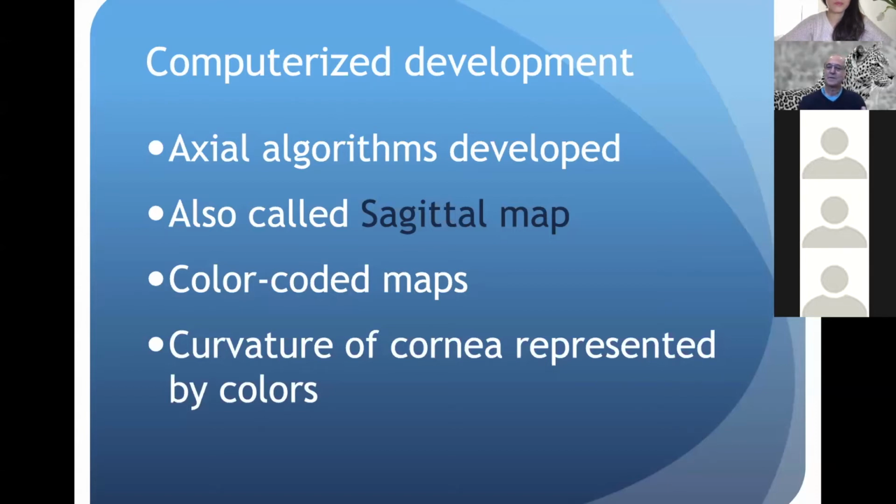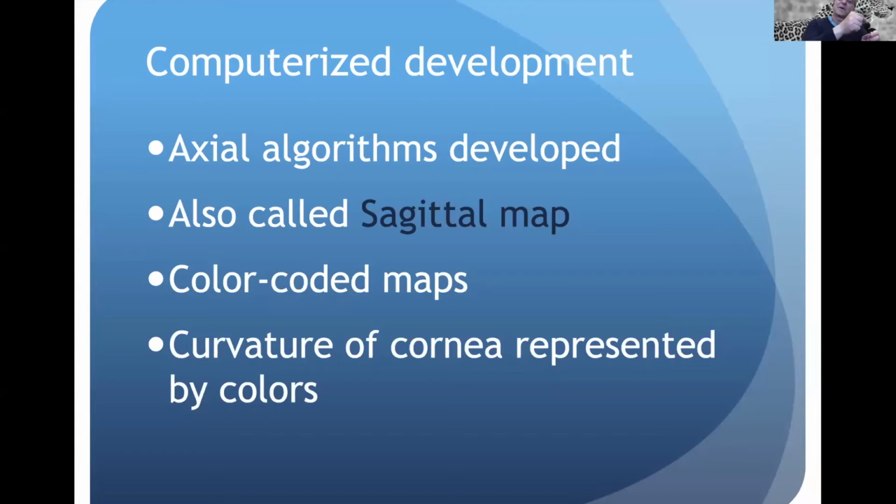And I was fortunate to be at LSU at the time when he was developing the color coding. It wasn't even a printer, it used color marking pens that were computer controlled, and it would color these maps and give us these beautiful printouts that we're so used to seeing now. So, little did I know that I was in the presence of the person that developed an instrumentation that was instrumental in helping us understand the cornea.